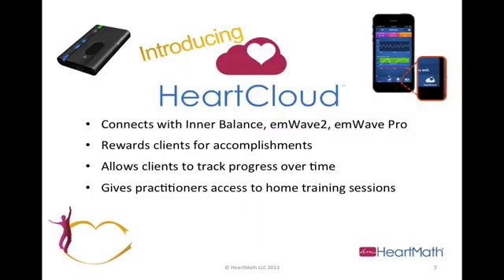Heart Cloud. This is a neat new feature. For those who have HeartMath devices, they can now sync their sessions up to this Heart Cloud web-based service, and you get rewards for certain levels of accomplishment, goals that you've met, and allows you to track your progress over time, and also gives you the opportunity to gain access to client home sessions if they give you their username and practitioner password.